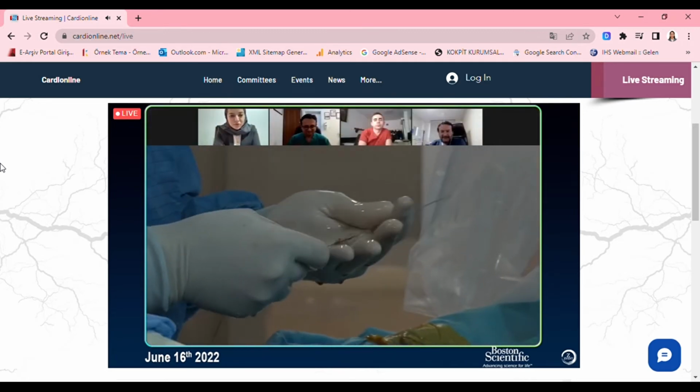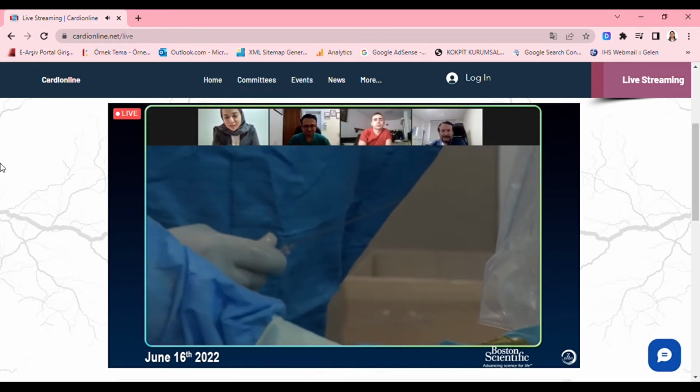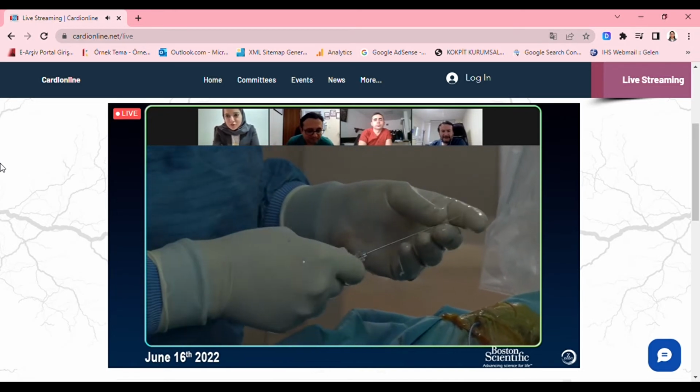So what do you guys do if it's an RCA? Do you still use a pacemaker, or do you use aminophylline?